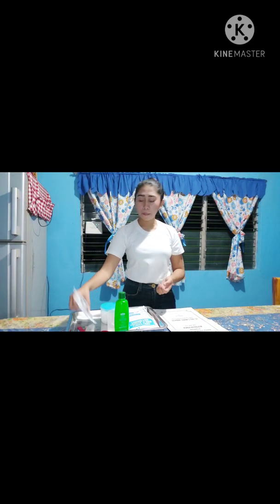So these are the materials. The materials that are needed are the macro set. This is a macro set. It is a larger tubing which is better for delivering large doses of medication. Then a micro set. A micro set also looks like this, but it is used for pediatric patients, and it's also used for small amounts of medications that are needed. So, the difference between a macro set and a micro set.